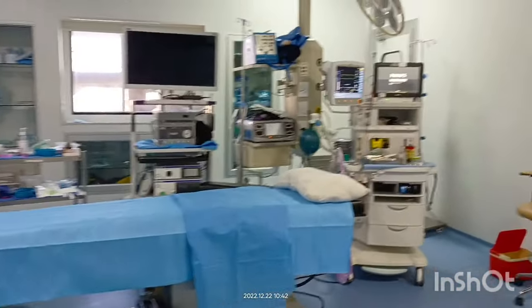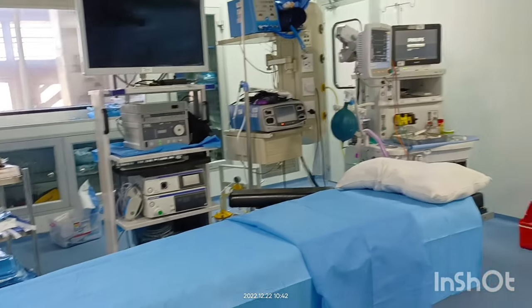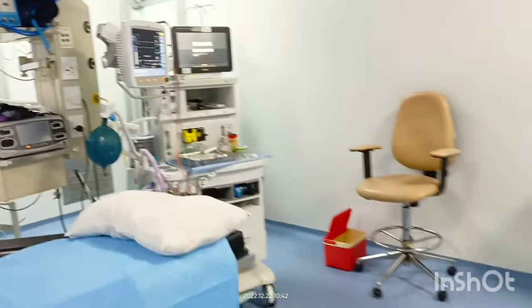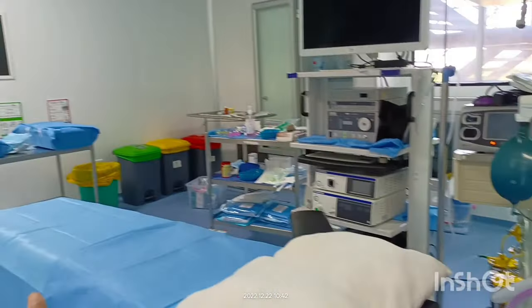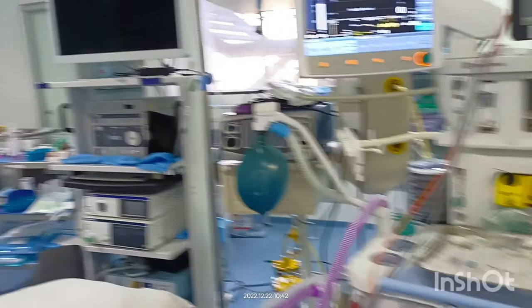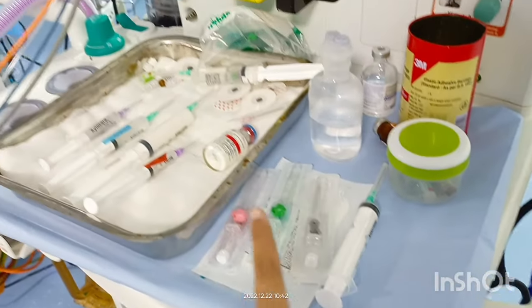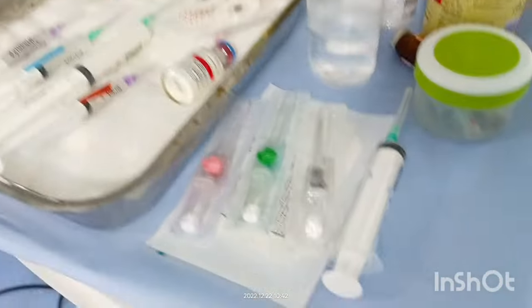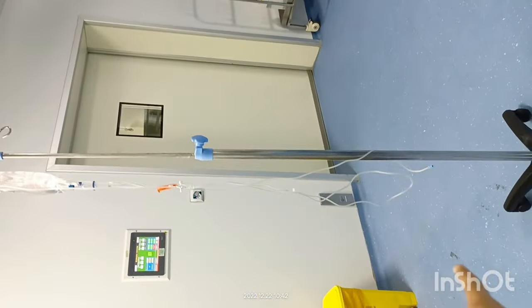This is the operation theatre. The patient is about to come, so our job as anesthesia technicians is to take care of this area. The first thing doctors do when the patient arrives is cannulation, so we must be ready — keeping the injections, gauze, and plaster ready for cannulation.